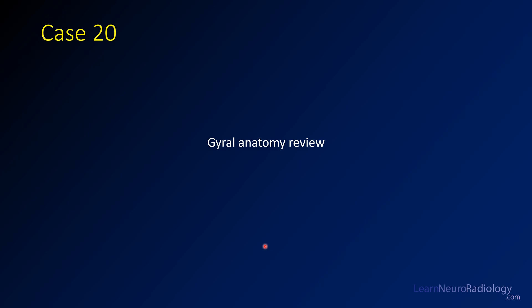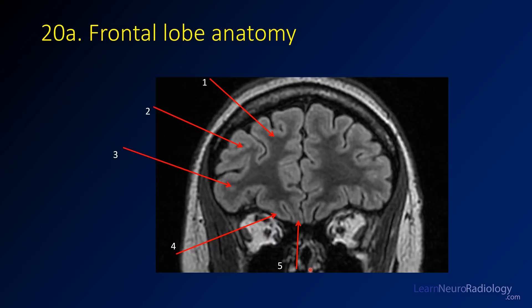For this final case, it's not going to be so much of a single case, but it's going to be a quick review of gyral anatomy within the brain. What I'm going to do is show you a single slice or an image through the brain. There are some numbered arrows, and I want you to follow along as we try to name them.